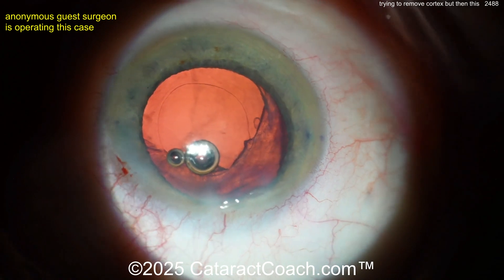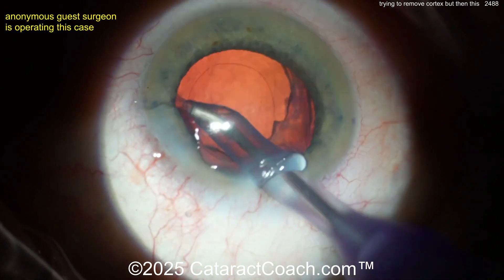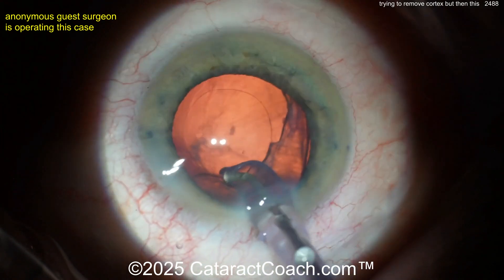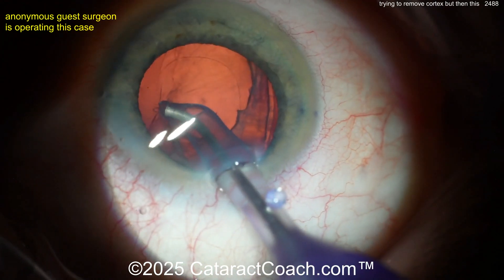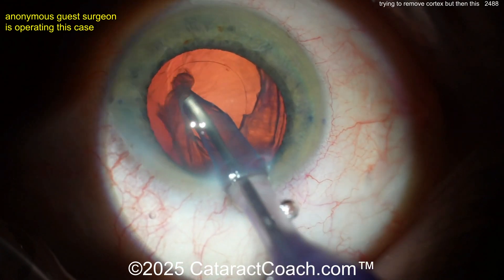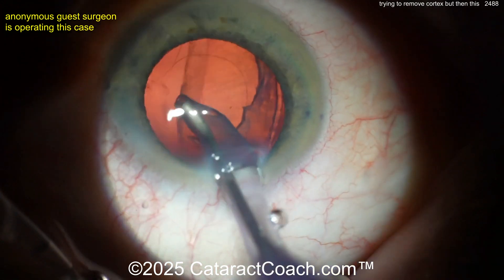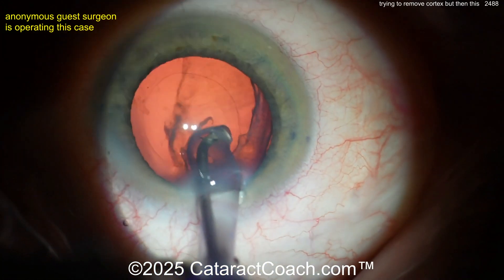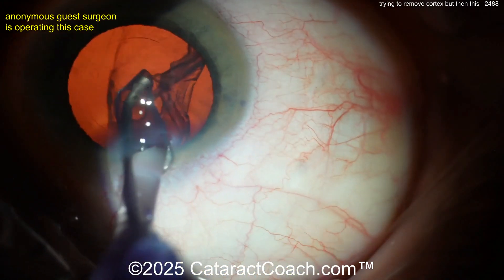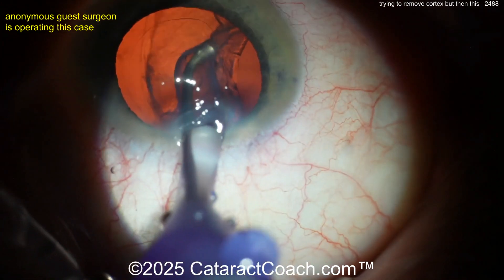Could you put in temporary support hooks? That would work. Switch to a bimanual IA removal for the cortex — that works too. Going in with coaxial, but look at the right side of the screen: you can already see the lens capsular bag equator — that's the danger sign. Now going in for cortex removal. Look how the whole bag is loosey-goosey. You're getting the cortex, doing a pretty good job, but moving to the right — what are you going to do now? There's obviously a big sheet of cortex here. If you grab it there, that's the equator. Zonulopathy is terrible and you're inducing more of it.